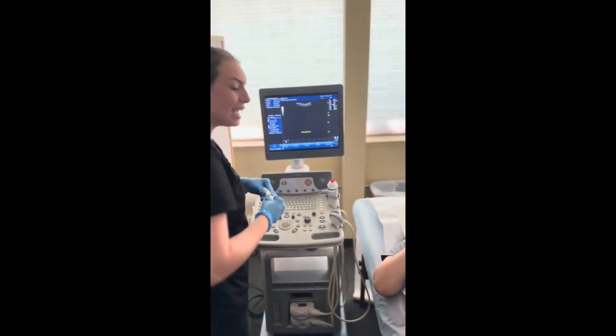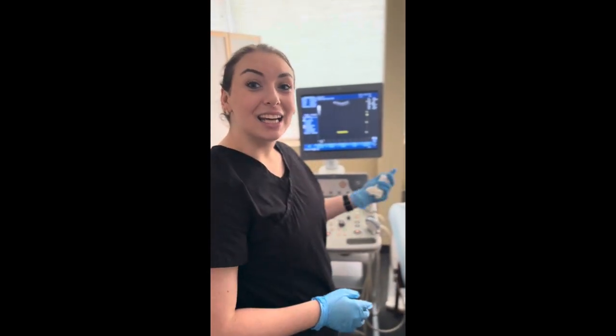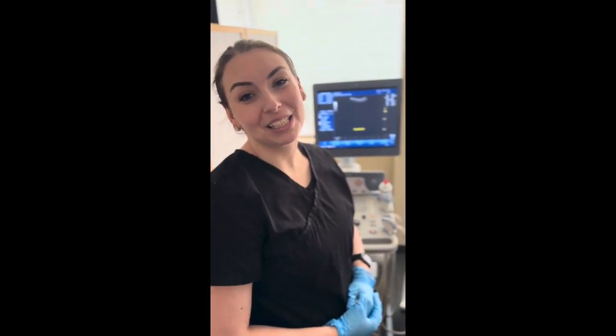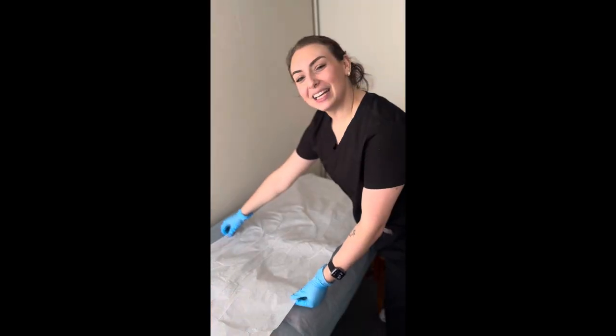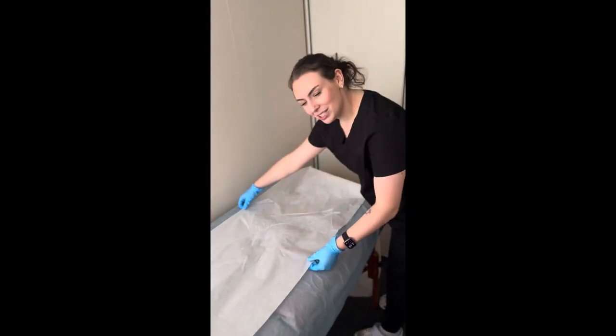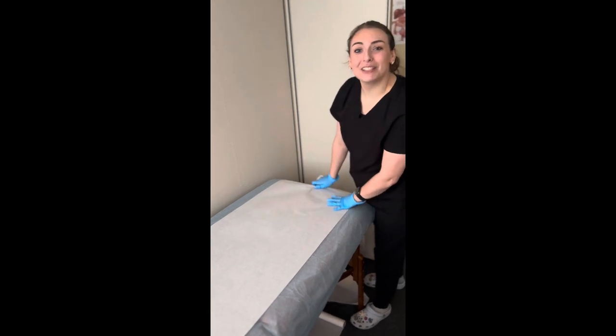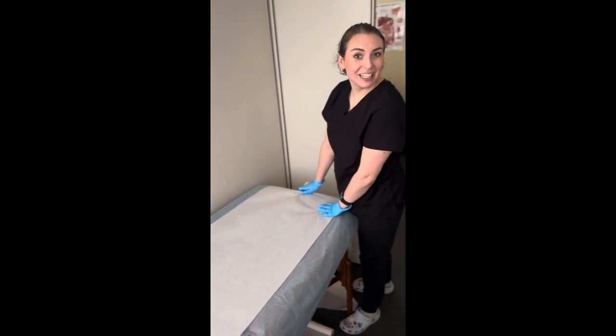And once the patient is out of the room, I like to clean my probe and send over the pictures to the reading physician, who will then of course contact the patient with all the answers. We're going to go ahead and clean the bed, reset for our next patient or sonographer. After that, I'll dispose of my gloves in a proper manner, and then we're all done for the day.